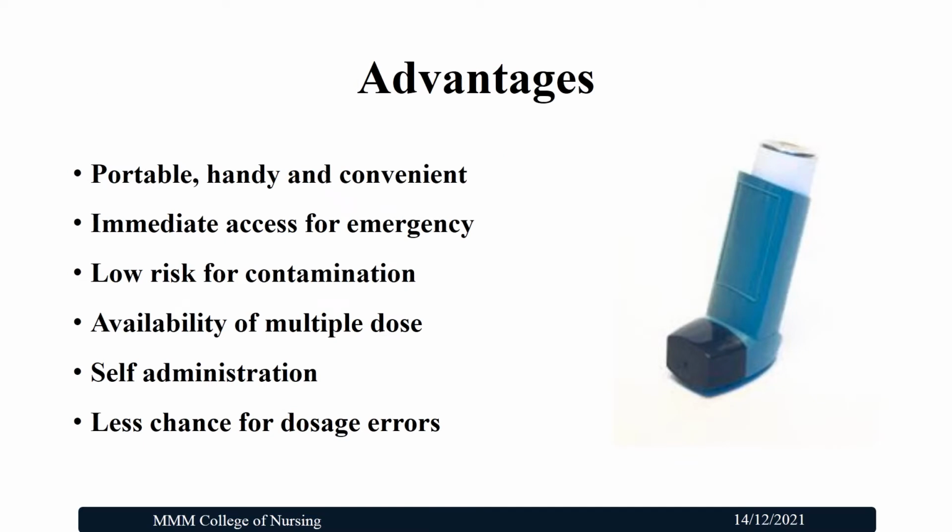The pressurized metered dose inhaler has many advantages. It is portable, very small and handy, very convenient to carry with the patient all the time. Even in a small purse they can place it and have it with them all the time. As it is portable, it gives immediate access in case of any emergency.